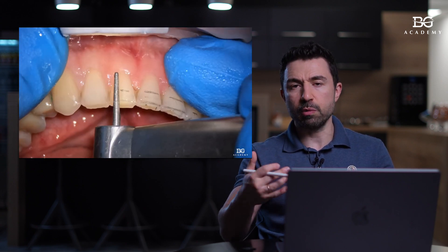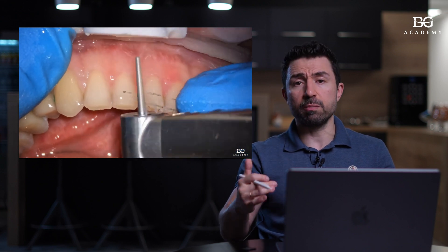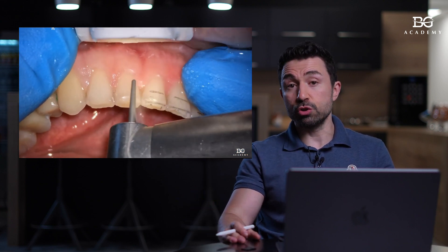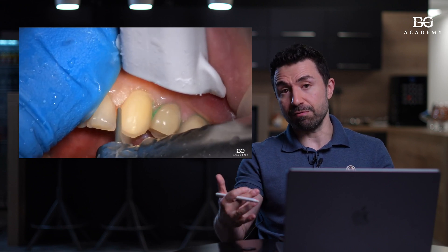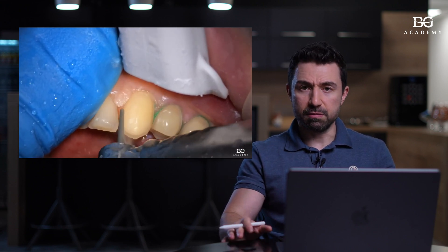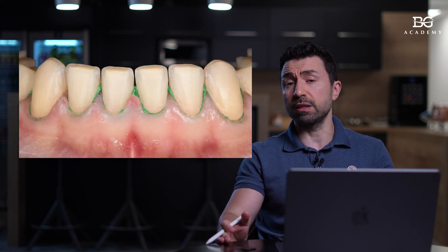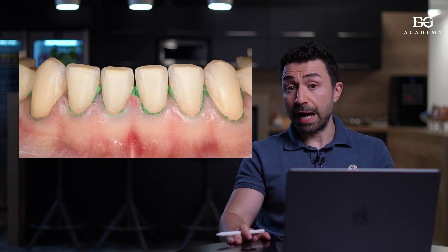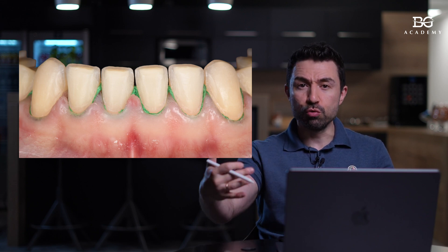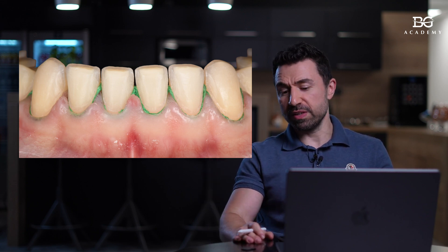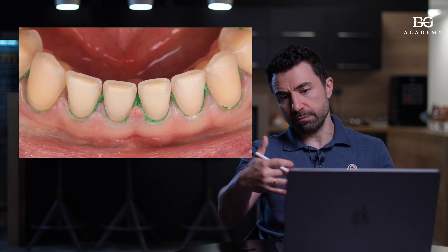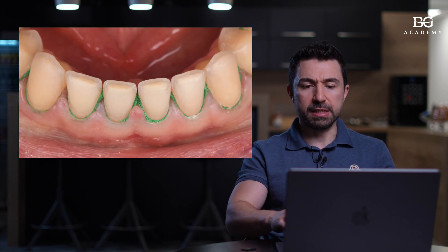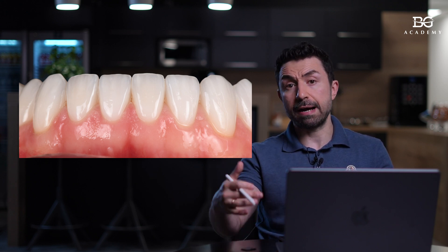In this particular case, we were more or less aggressive in the incisal part of the teeth, but in the cervical part you can see that we are pretty good in terms of space. So we are additive in the cervical and middle part, and a bit invasive in the incisal area of the teeth. We started to prep the teeth with the mock-up, then finished all preparations. As you can see, there are still conservative preparations for porcelain veneers, guided by the mock-up from the non-reduced model with the wax-up. Here is the final result after ceramic restorations were bonded.